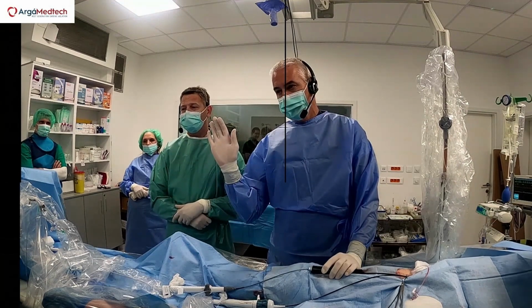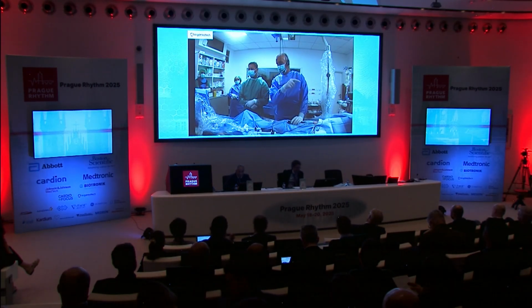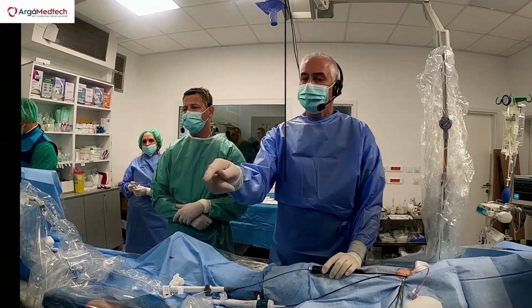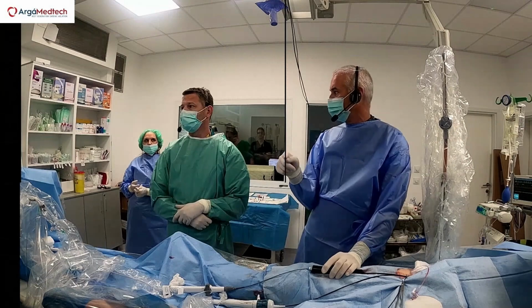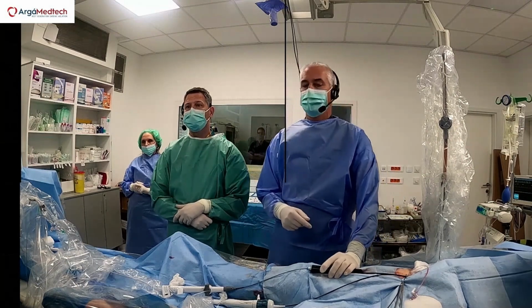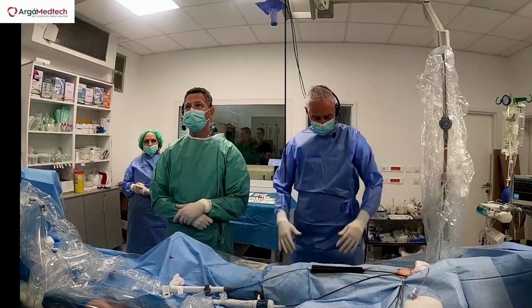Very fair, because this patient will undergo remap. They have to remap. I'm going to reblade. I have a very good feeling about leaving this CTI with a single application, and we're going to remember the lesion set, and we're going to report the durability next year to Professor Kastner. Okay, fair. We're done with the case then.